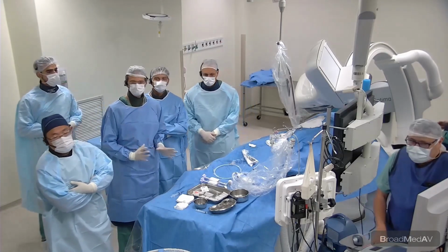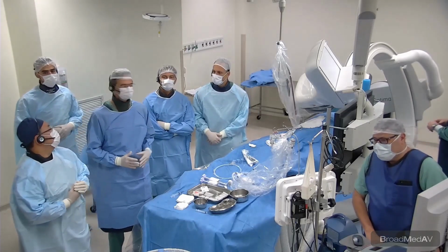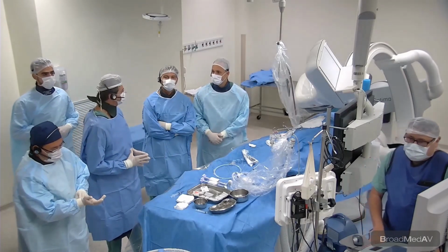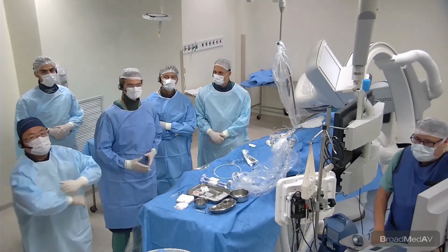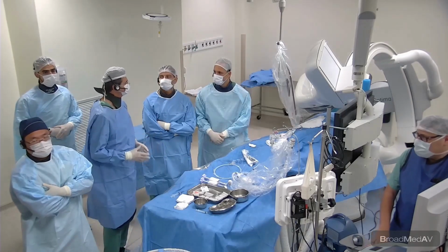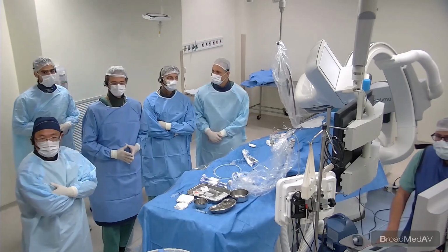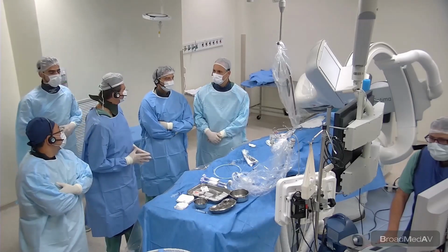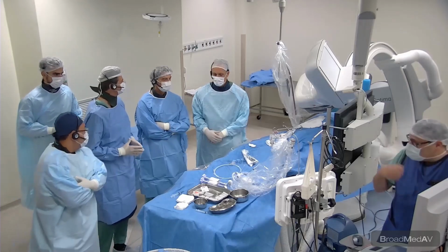Let me tell you, I was here in the cath lab late in the afternoon yesterday, and we saw this diagnostic case being performed. We were supposed to do another case, but this case came from our routine. That's very important. This patient probably had a tight left main since November when she had the stress test. Now she came to our cath lab, we saw the anatomy and decided to bring this case today. So what have you done so far, Rodolfo and Ricardo?